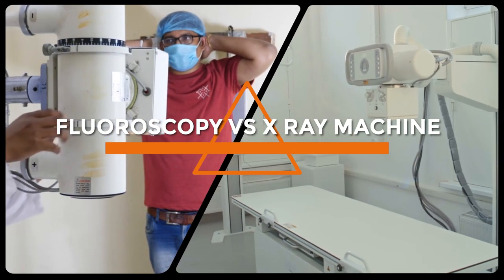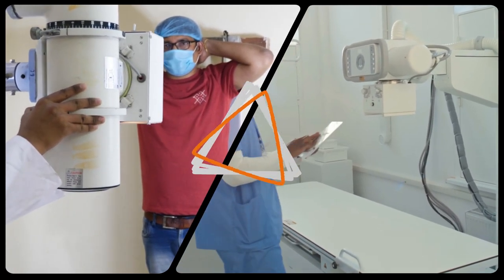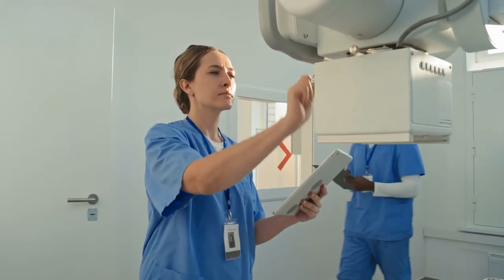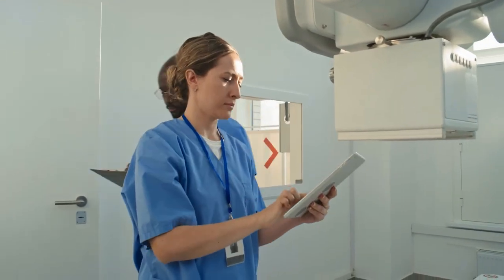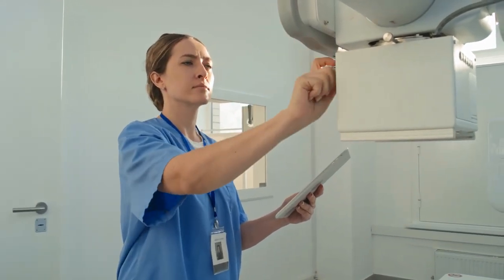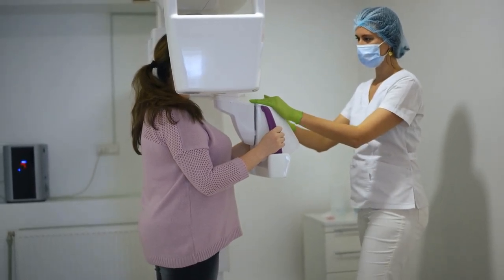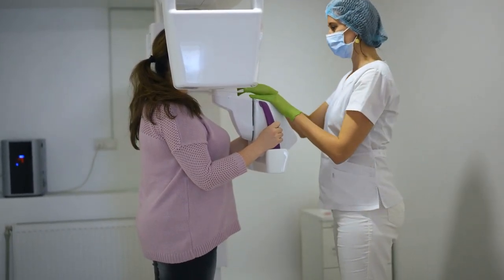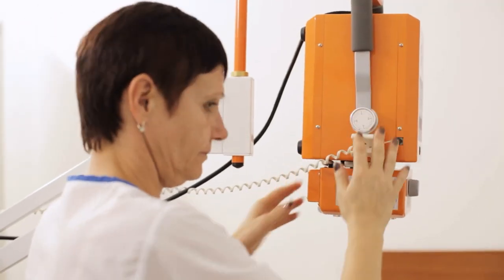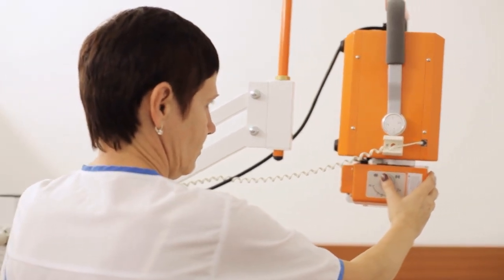Welcome to our video on fluoroscopy versus x-ray machines. In the world of medical imaging, there are many different types of equipment that doctors and technicians use to help diagnose and treat various conditions. Two of the most common are fluoroscopy machines and x-ray machines. Although they share some similarities, they are also different in important ways. In this video, we will compare and contrast these two types of machines, looking at their technology, applications, and other factors.